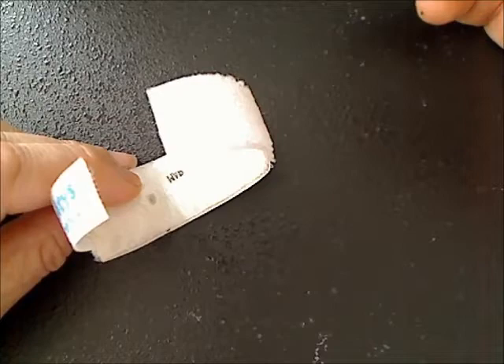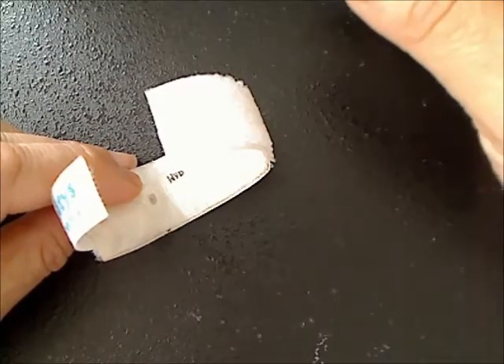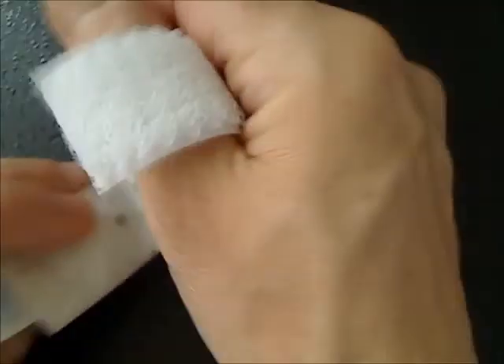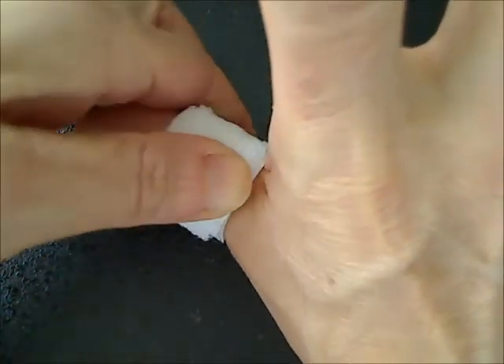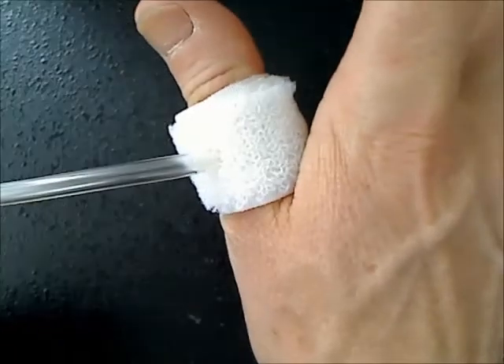The occlusion cuff is placed on the base of the thumb, as low as possible, like this.